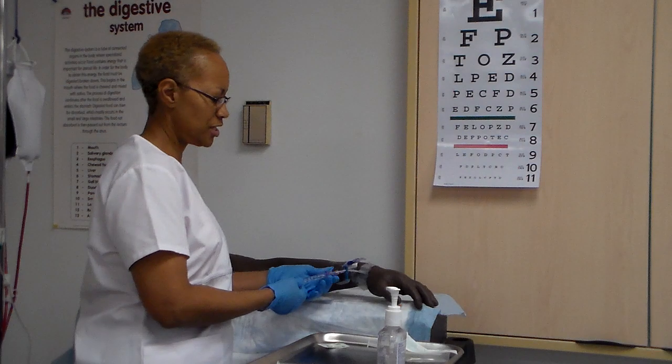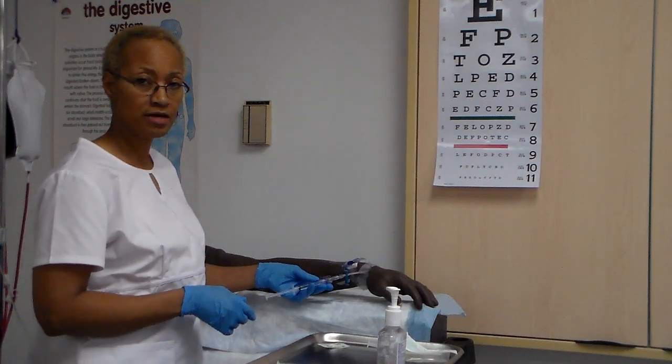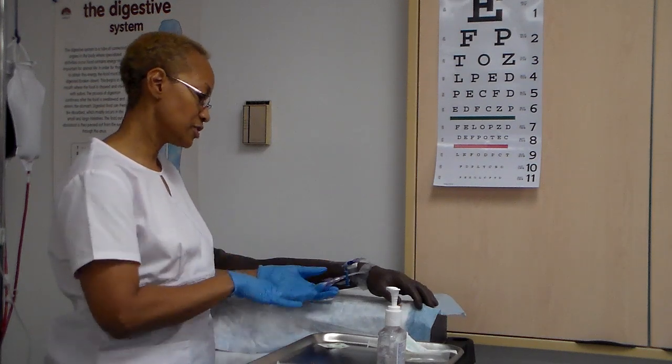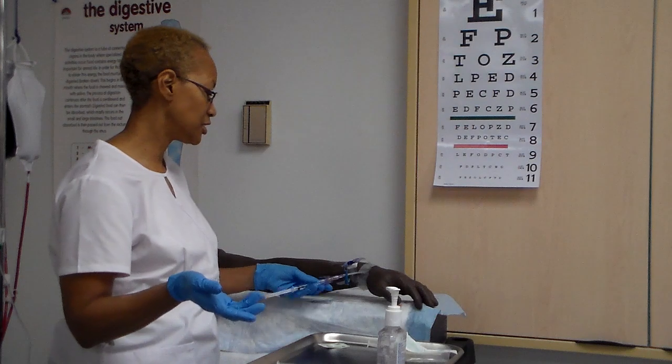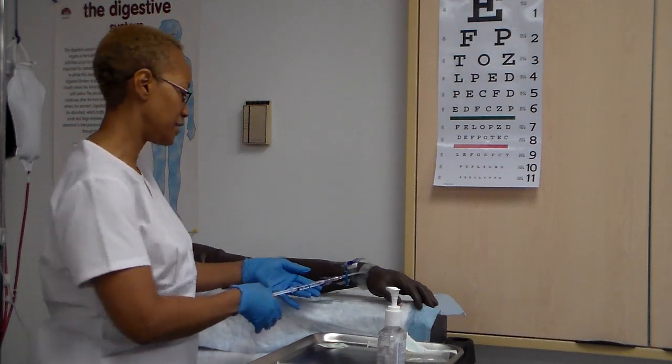Now this has saved many nurses, reduce the risk of nurses having needle sticks. So they're a wonderful system. If your hospital, your facility uses a needleless system, that's exactly what you want. So when you get in charge, really push for that.